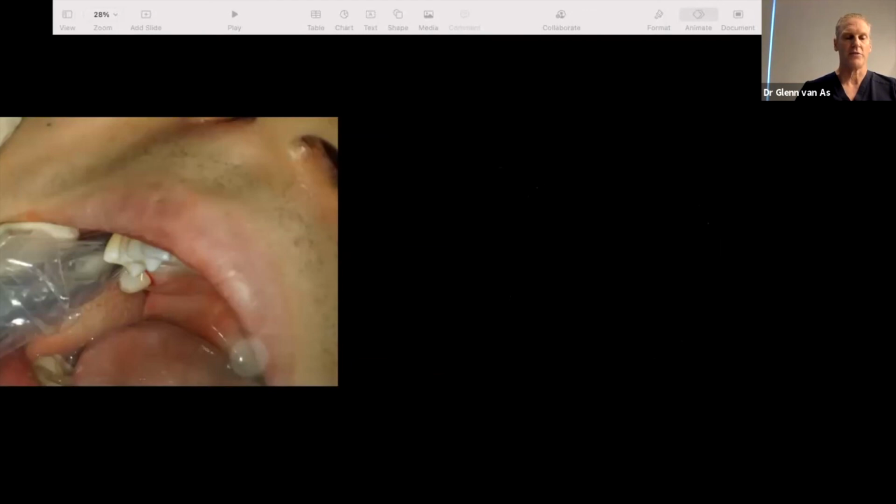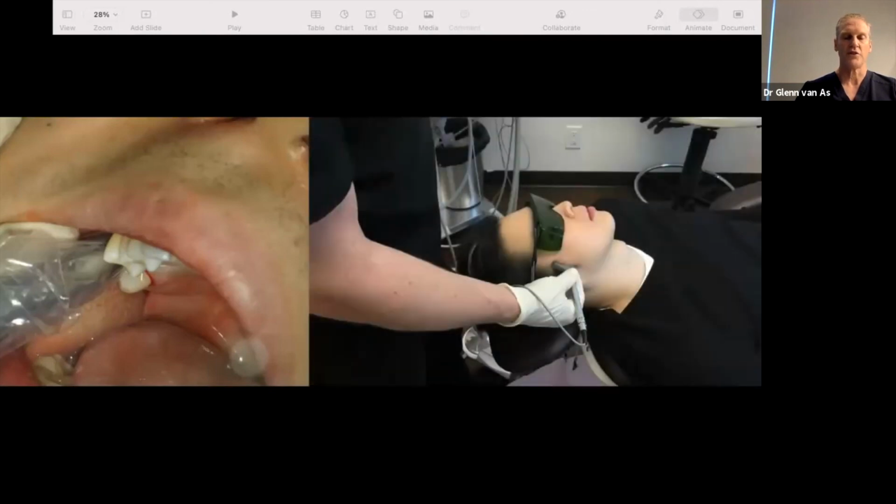And also, because he was open for quite a while, we use it with a bleaching wand over the TMJ, 2 minutes. Just over the TMJ, have them open and close slowly. And the patient will say, it's amazing how much better my jaw feels just after the 2 minutes of you utilizing it on both sides. Don't use it on one side only. I've heard people having vertigo after this. I'm not sure, but I'm just telling you, use it on both sides.